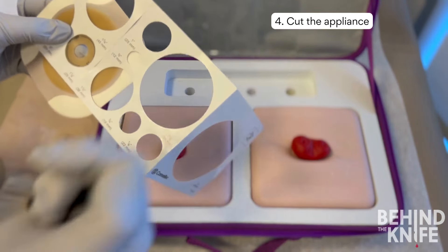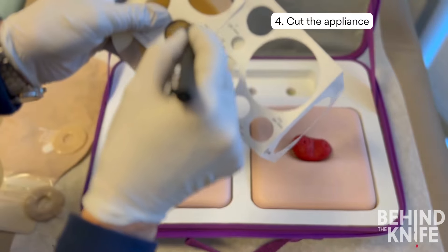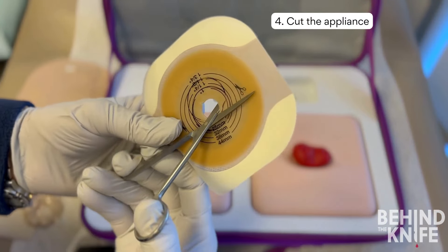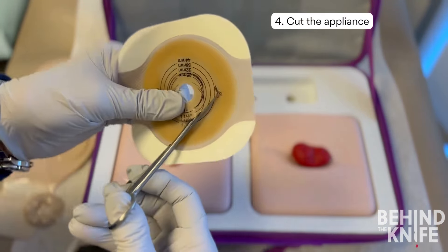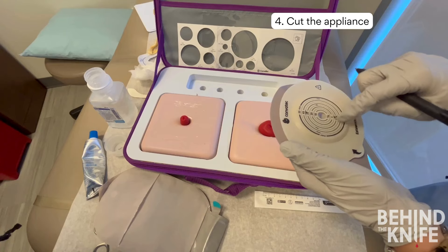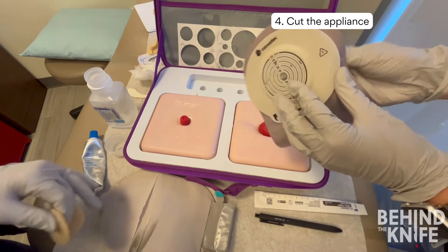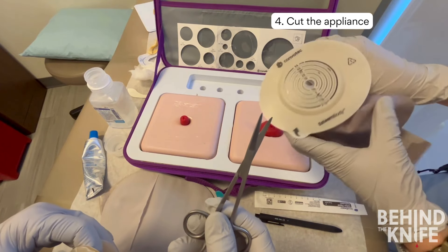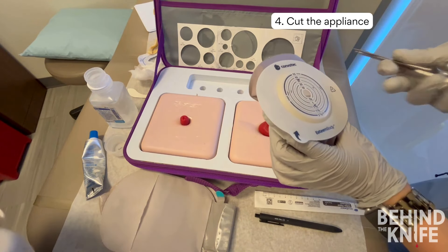I have two pro tips to share with you when cutting an ostomy appliance. First, you can always cut the circle slightly off-center if you need to adjust for a midline incision or another drain. Secondly, if cutting a one-piece appliance, always pull the bag portion away before cutting. This will save you from accidentally cutting the bag and not realizing you have a leak until after the appliance is in place.